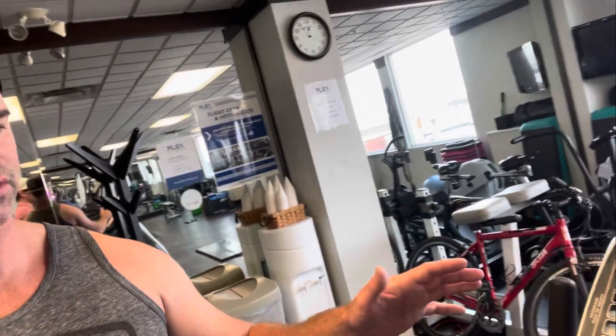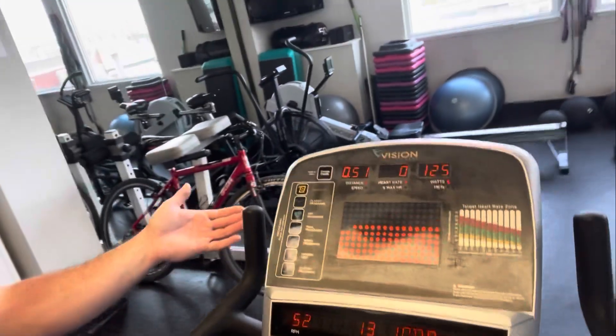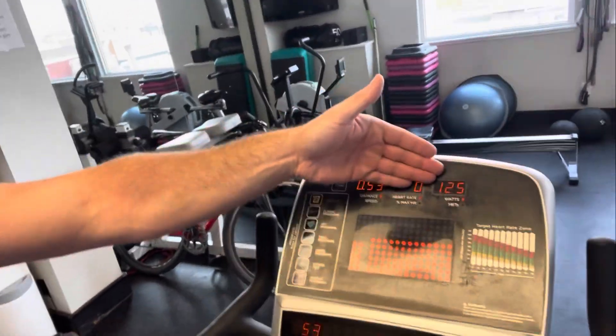The most important minutes are the 5th and 6th minutes. You want to record those two beats-per-minute readings because it'll be the average heart rate for those last two minutes within the six-minute segment. Once the six-minute segment ends, you'll have a change in wattage — for males I'll jump by 50 watts, so up to 125. Again, at the last two minutes of that stage, get the average beats per minute.